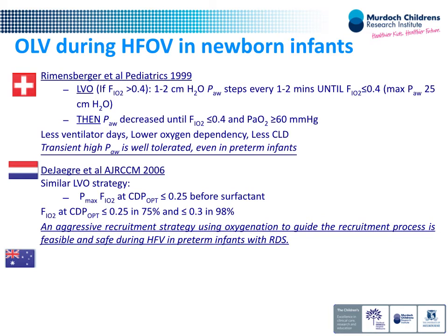Could you please tell us if you care for 23, 24, 25, 26 weeks, maybe? Because that affects it. So in Australia, 33% of babies under 25 weeks are still put on an oscillator in Australia in 2012 from our database. And we are probably the most aggressive non-invasive place around the traps, I reckon, in terms of our enthusiasm for it. So we are still using this, particularly in these babies.